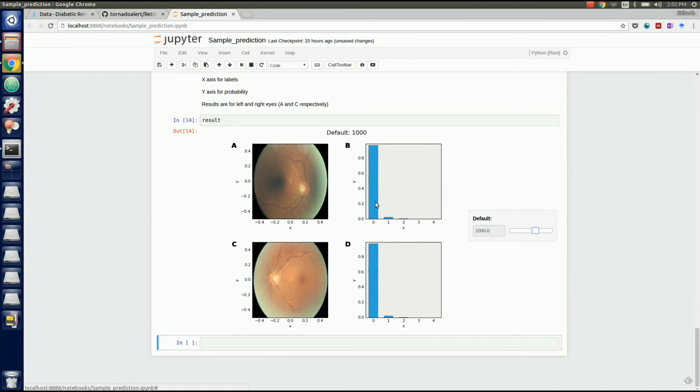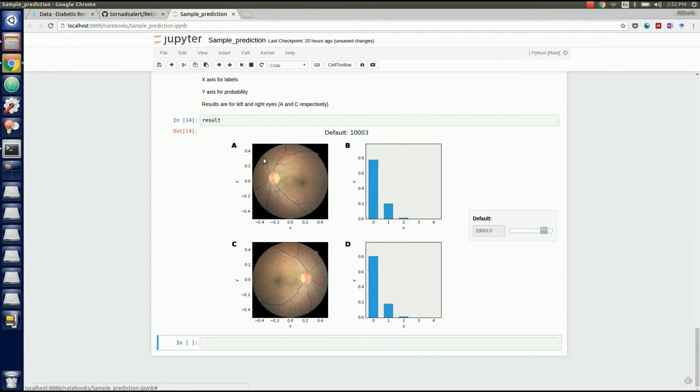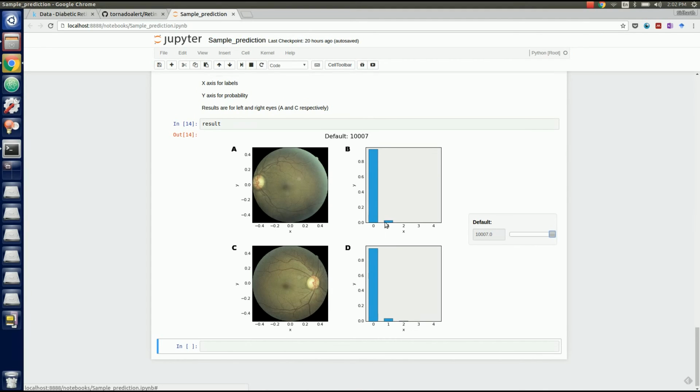So this is normal, yeah. No signs of microaneurysms, so that's normal. This too, this is normal, and notice that there is an artifact here, but that is an artifact, and it still says it's normal because it is. And in the end, this is normal too. So in this test scenario, it got all of it right. That's 100% accuracy rating.